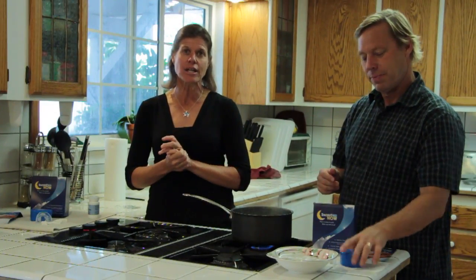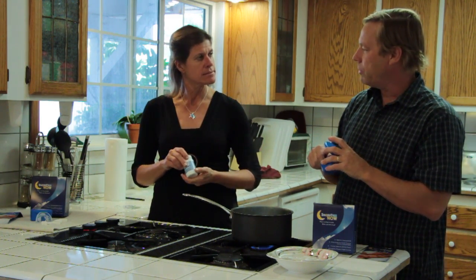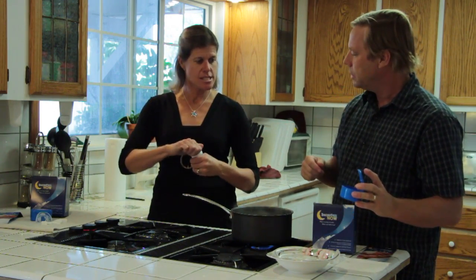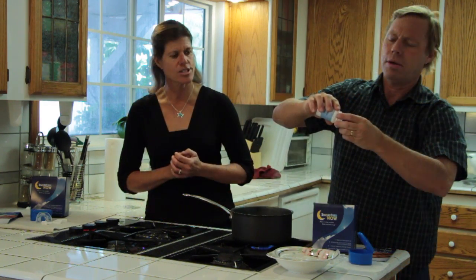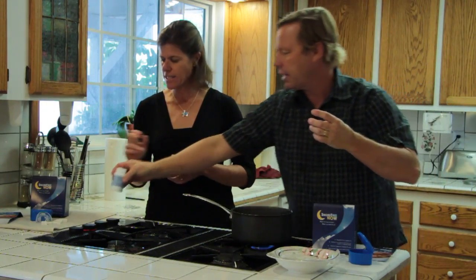Roger has a really good idea of keeping it clean. Yeah, I was reading the instructions, and it says to mix it with 1/3 of a cup, and I found out that this holds 1/3 of a cup. Brilliant. So let's try giving it a clean. So it said half a teaspoon. It's just enough to get it so it's cleansed. Okay, that's about a half teaspoon right there. That's good.